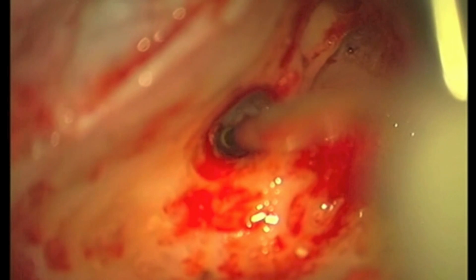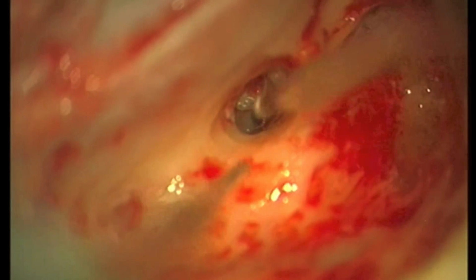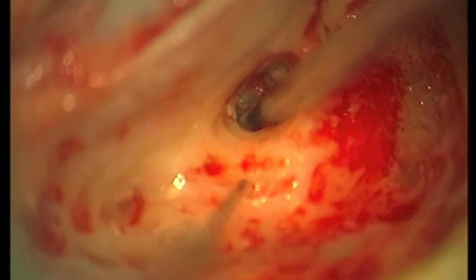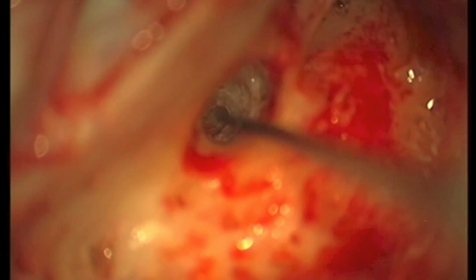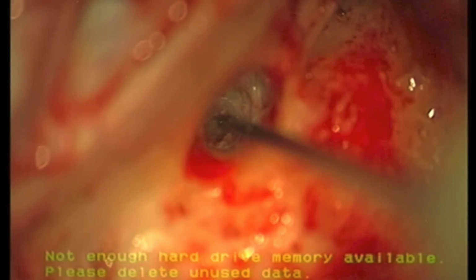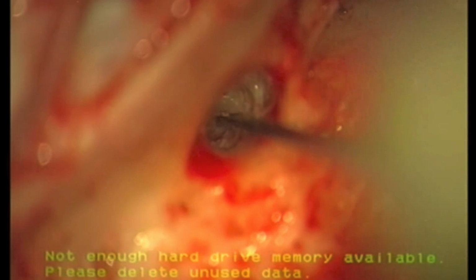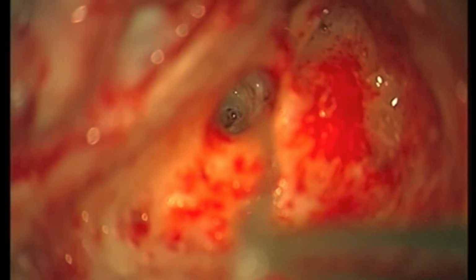So the bone's been removed behind the ear. There's a tiny little hole drilled into the middle ear space where the cochlear is situated. And you have to drill away a little bit of bone to expose one of the membranes that is into the inner ear. When the drill's away, you can see the membrane. So this is the membrane here. And you have to make a little opening in that membrane. And then the electrode is slid in through that hole.